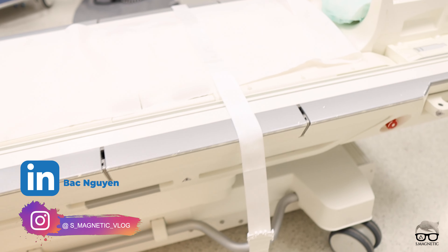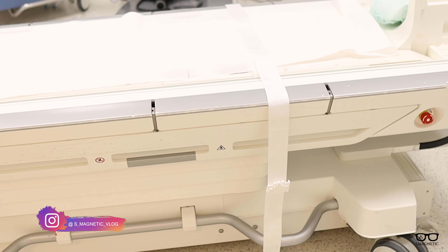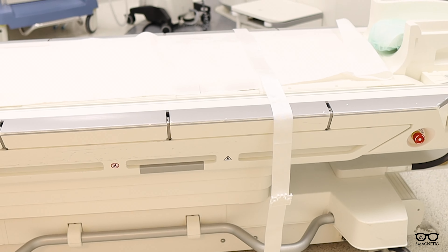So what in the world are these straps for? Tune in and I will show you how fast you can work with those straps.